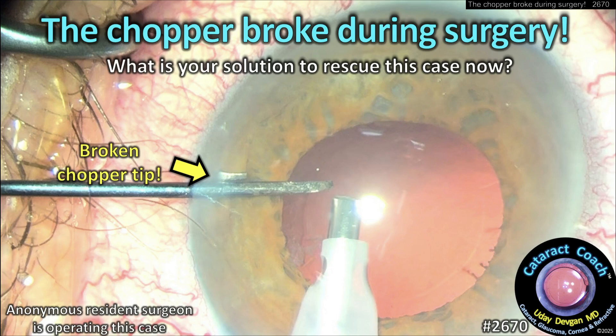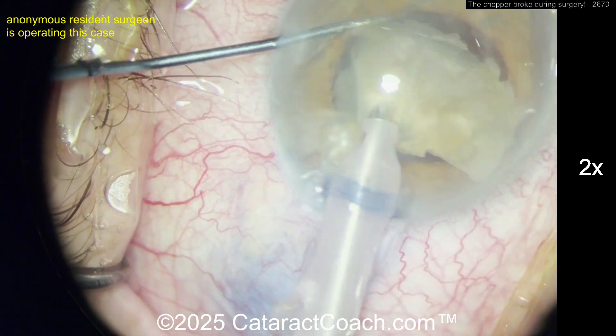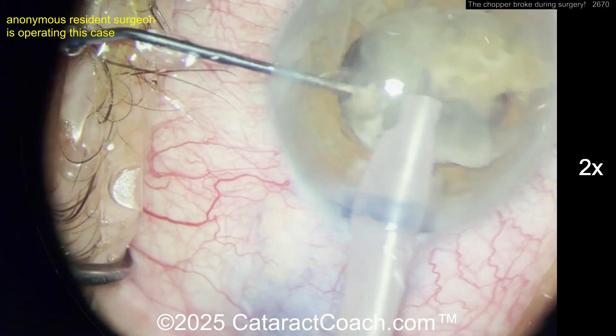cataractcoach.com — the chopper broke during surgery. Now what's your solution to rescue this case? As you're operating, imagine that the tip of the chopper breaks off, and it could be dangerous inside the eye. Here's the case: we have a resident who's operating.